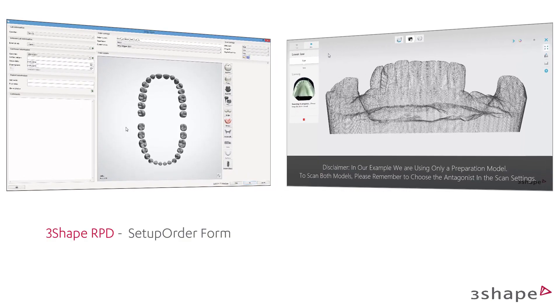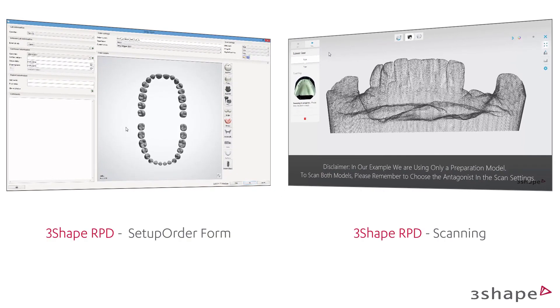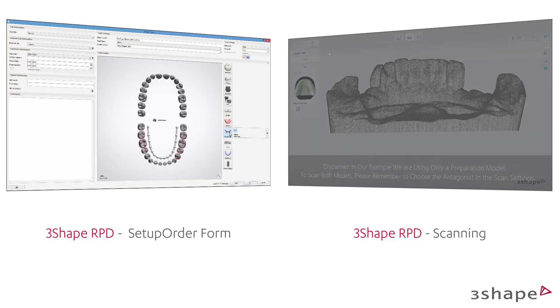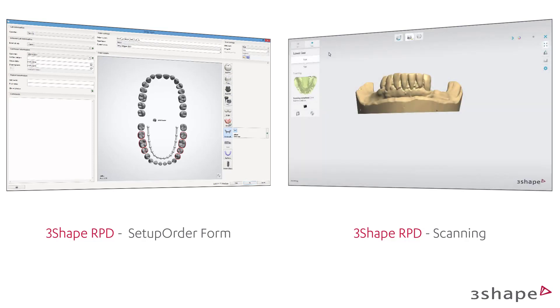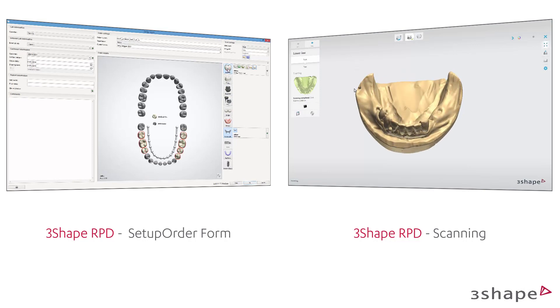In this video we will show you how to design a flexible partial denture. Begin with creating the order form and scan the models or import previously scanned files. To learn more about how to do that, please watch our RPD videos.